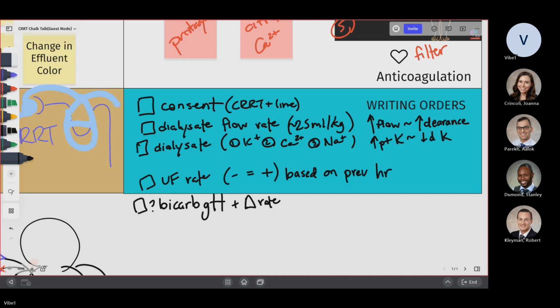I'm just wondering. Yeah, if you're having access issues, you probably shouldn't be using your dialysis catheter. You should be figuring out why you're having access issues and address it that way. I think they're exhausted with the accesses. Oh yeah, then you can use your dialysis.